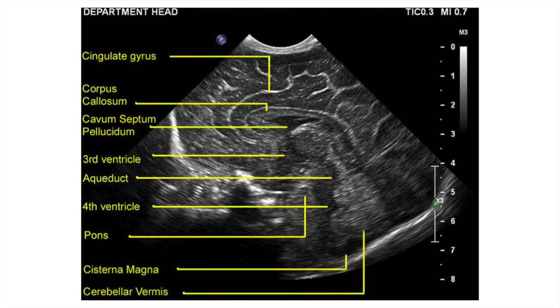Always start by first obtaining your midline sagittal view. This is a good reference point to ensure that you're in line. In the centre, you can see the dark image which is your cavum septum pellucidum. Above this, your corpus callosum, and below this, your third ventricle, your fourth ventricle, and to the back slightly, your echo-bright cerebellum.